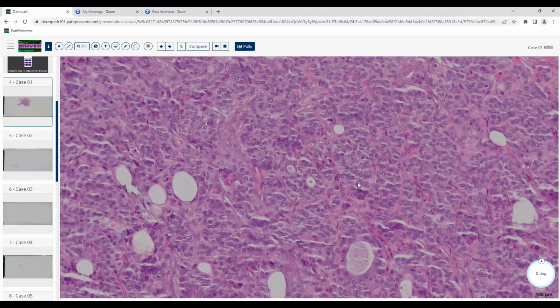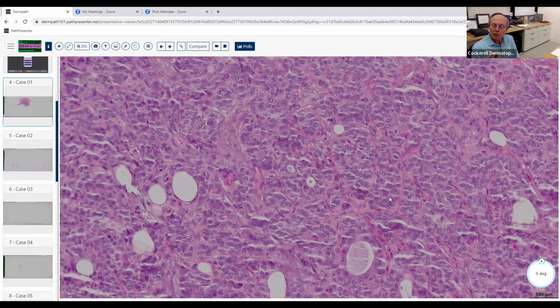Are these like basaloid, like spindle cells? Well, that's spindle. Notice how they're round. Just think, what kind of normal structure in the skin gives you small, round, homogeneous basophilic cells, but not super darkly basophilic, like a lymphocyte or a stem cell of the outer part of a sebaceous gland? What other parts of the skin appendages can give you these round cells admixed with cells that have slightly clear staining cytoplasm, and they have ductal differentiation also?